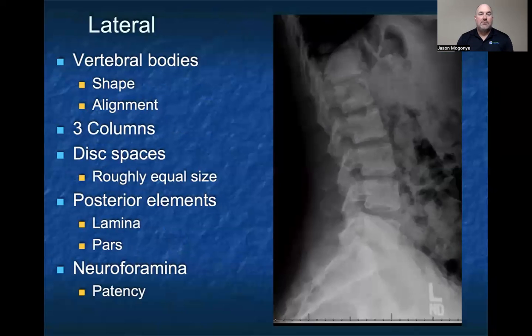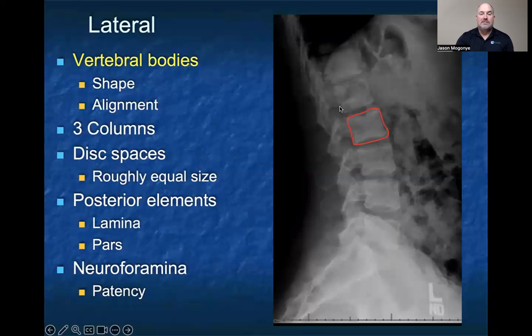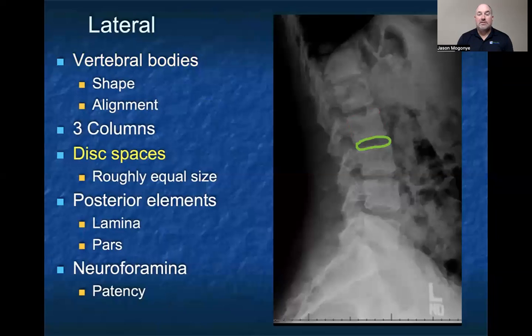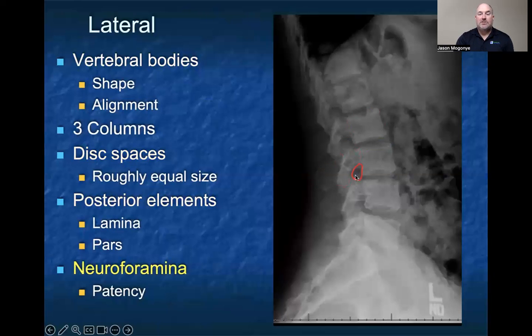On the lateral x-ray, you want to look at the vertebral bodies. We'll talk about the three columns, the disc spaces, the posterior elements, and the neuroforamina. Specifically on the vertebral bodies, you want to look at the shape — make sure that they're square, that there's not any wedging either anteriorly or posteriorly, and that most of them are shaped about the same. Check alignment of both the anterior and posterior vertebral bodies. This plays into our three-column model for fractures: you want to make sure you're paying attention to the anterior, middle, and posterior columns. Look at the disc spaces — make sure they're roughly equal in size and robust. Look at the posterior elements, the lamina and the pars interarticularis. And the neuroforamina — you want to make sure they're patent, as osteophytes can impinge those exiting nerve roots.